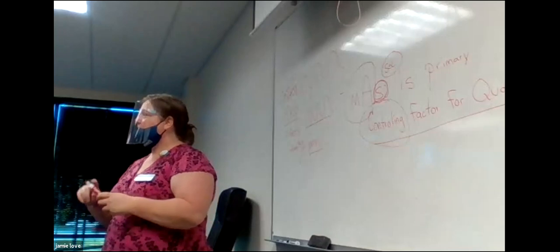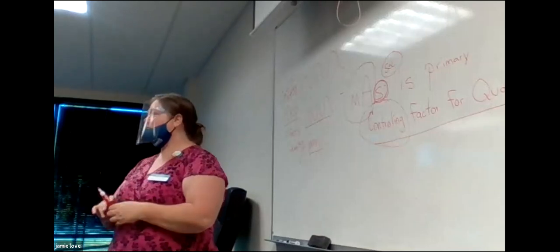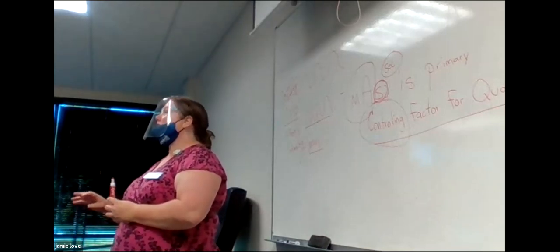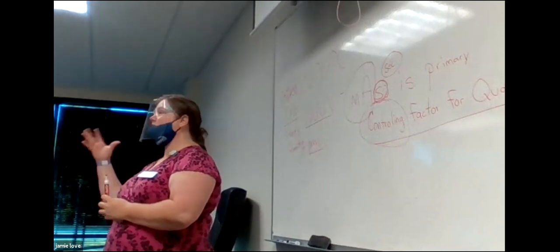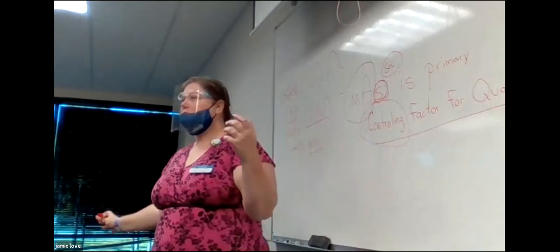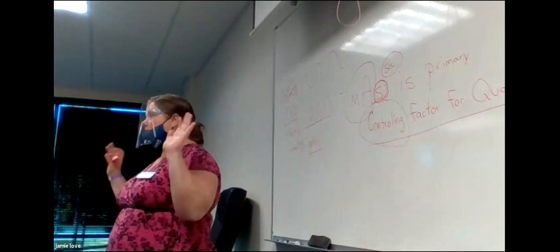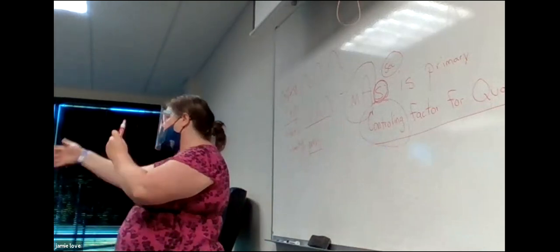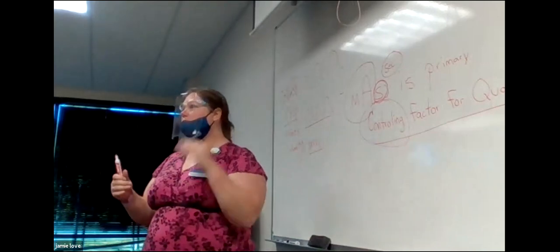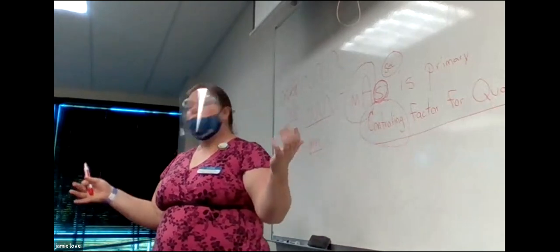Is that what you selected yesterday to make a longer exposure so we could see it light up for longer? If you have it at like 6, that's not what you would normally do. You wouldn't do that long of an exposure because it overheats the filament and might burn it out. We also don't want long exposures because of breathing and motion in the body. Motion is bad in X-ray. It blurs things out, like taking a picture of somebody running or a car driving. That's what happens to our structures in the body. So we want the short time so we don't burn out our tube and we can have less motion.